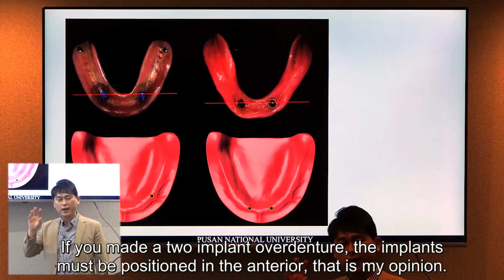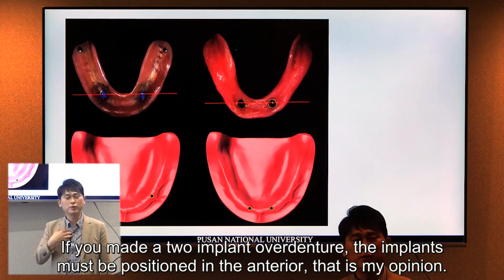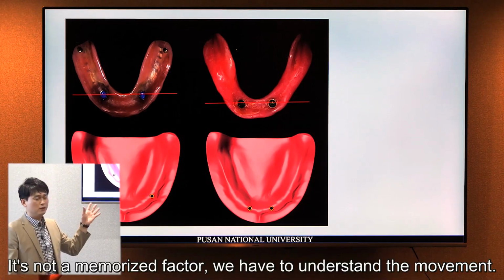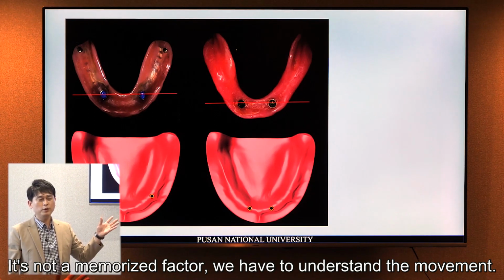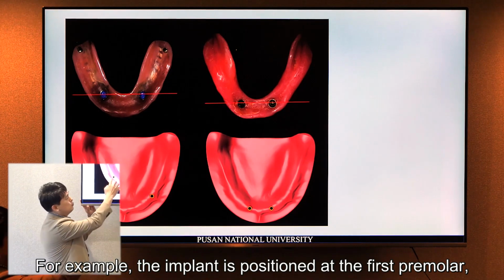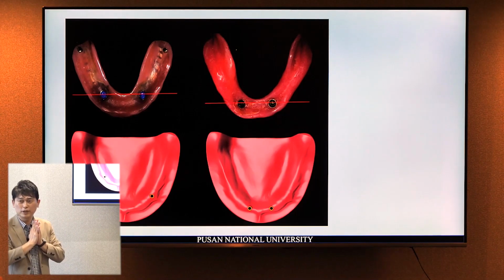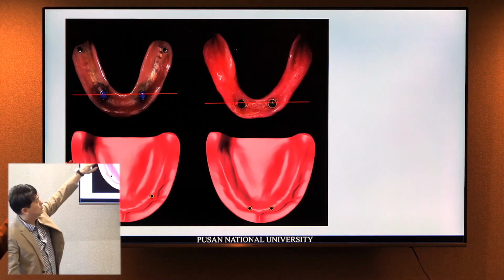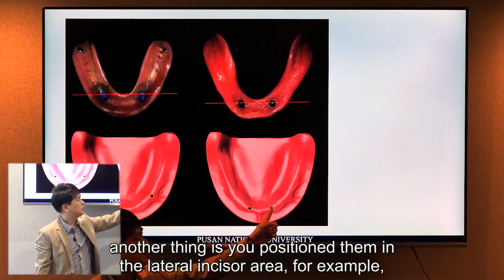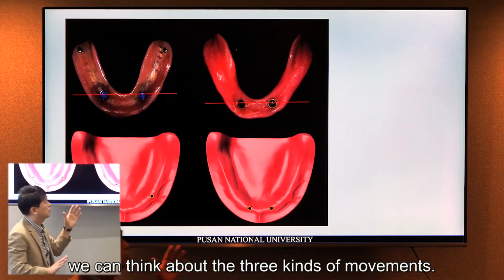If you make a 2-implant overdenture, the implants should be positioned in the anterior part. That is my opinion. Look at this. It's not something to memorize; we have to understand the movement, right? For example, the implant positioned at the first premolar, and another positioned at the lateral incisor area. So we can think about three kinds of movement.